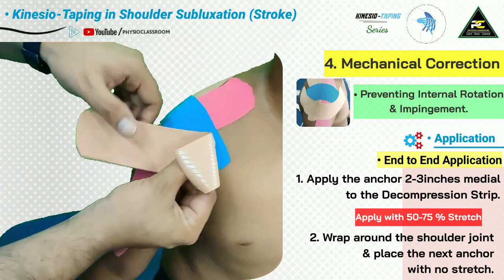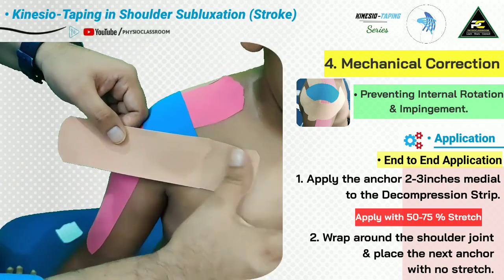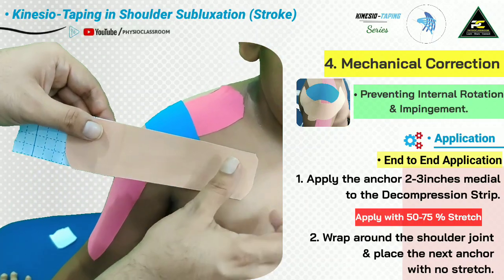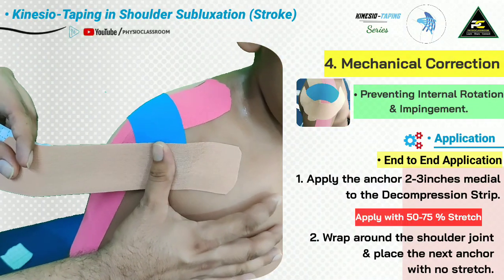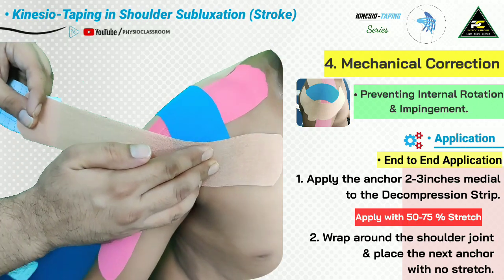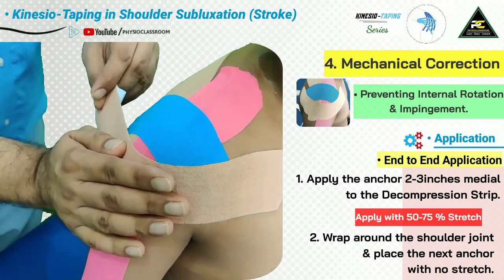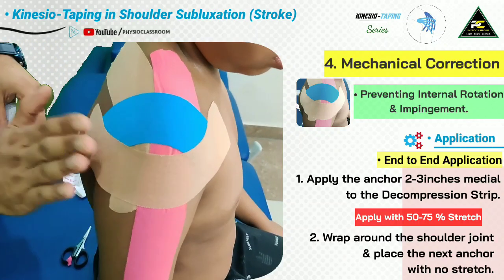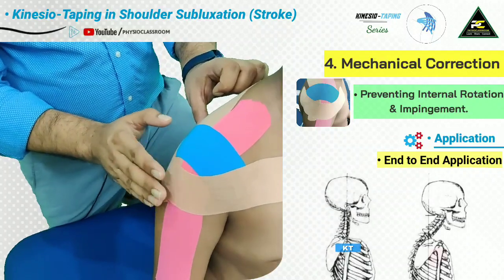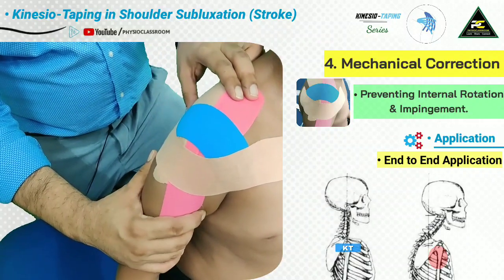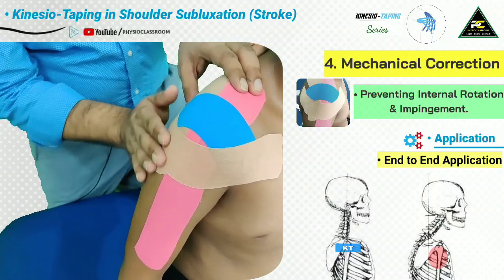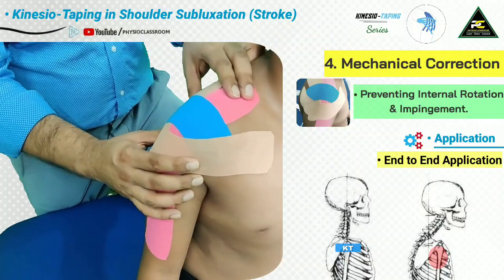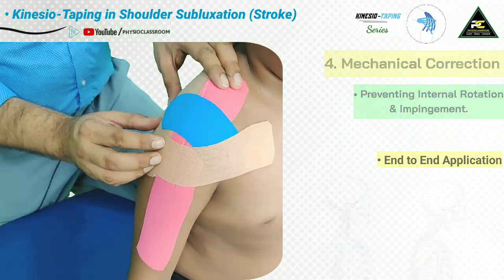Rub the anchor, then remove the paper backing, leaving some for the other side anchor. With pressure, move toward the humeral head. Once at the humeral head, apply tension of around 50 to 75 percent, then wrap around the shoulder joint and apply the posterior anchor with no stretch. Whenever there is abnormal internal rotation of the humeral head — the most common cause of impingement — the tension in this tape increases, sending a stimulus to the brain to correct the shoulder position back to where the tension becomes less.